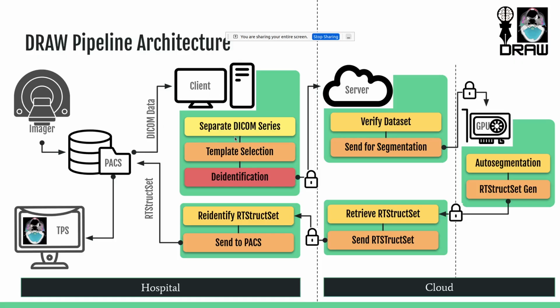It will copy that data, and then it will automatically attach an auto segmentation template associated with it. Now, what is this auto segmentation template? This is nothing but a text file which tells the auto segmentation system which structures are to be drawn for which patient. Now, we don't want all structures to be drawn for all patients, so that is why this template method is there. And this template selection and the rule set creation process is something that you can do through the UI, which means a non-technical user can easily do it. It doesn't require any coding.